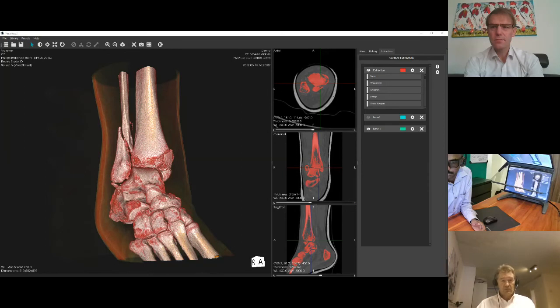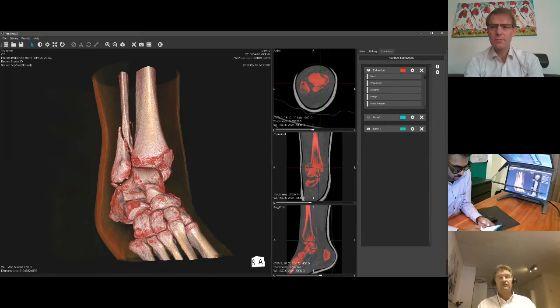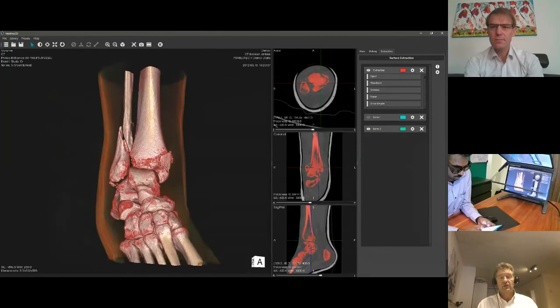And especially, to answer your question, for patients and people that want to use it in a limited way, for 1 patient, 2 patients, 3 patients, they can use it for free. The moment you want the true functionality like 3D printing, the VR settings, 3D interaction, extractions, or you want to connect it to a PACS, we have different pricing models for that.